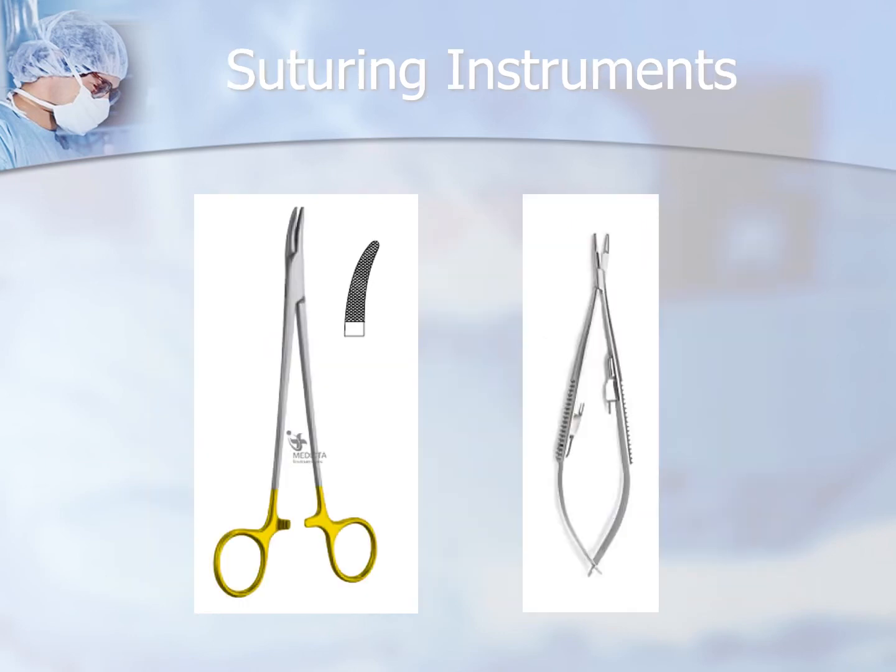Suturing instruments. We've looked at various needle holders like the Mayo-Hegar and the Halsey and the Webster. A couple new faces. This one on the left is called a Heaney needle holder, and it is a curved needle holder, typically used in urology and GYN procedures.